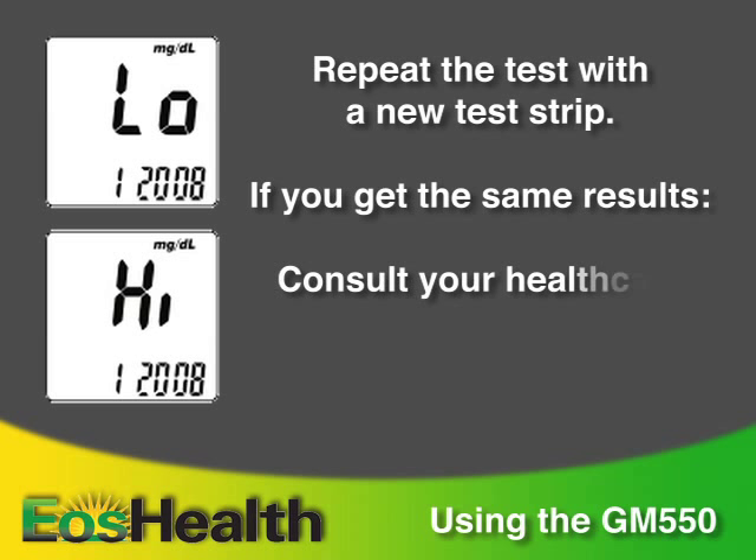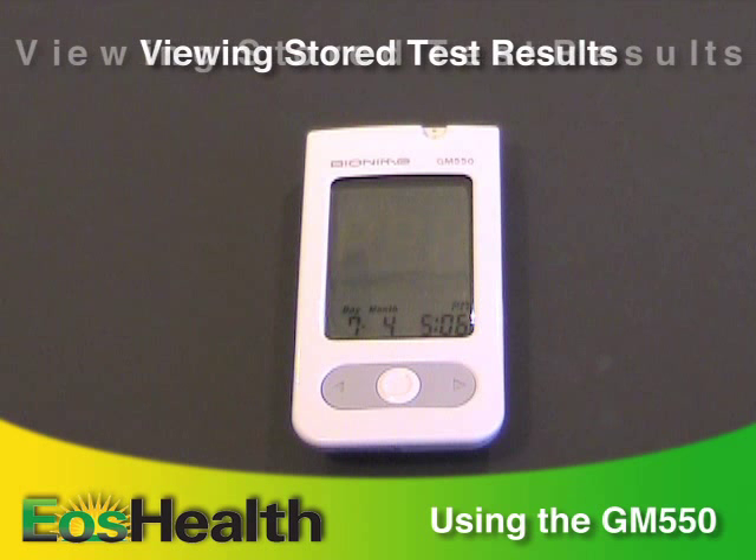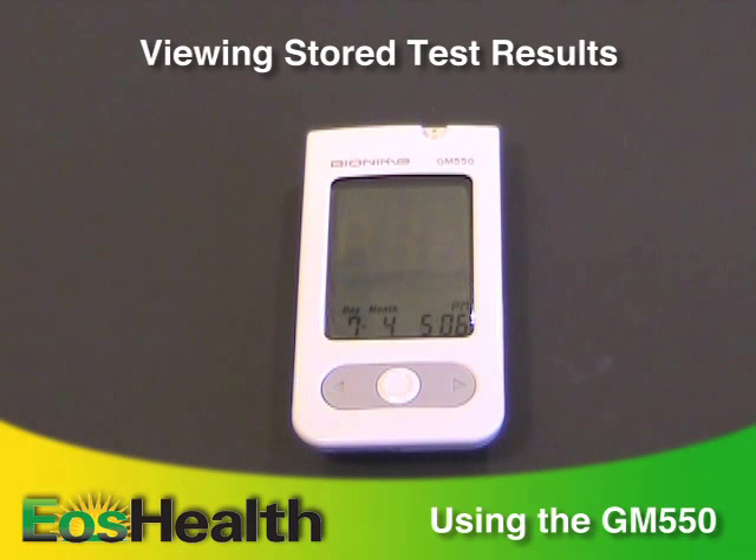If you get the same results again, consult your healthcare professional or call the EOS Health Nurse Line immediately. Your GM-550 meter can store up to 500 test results.